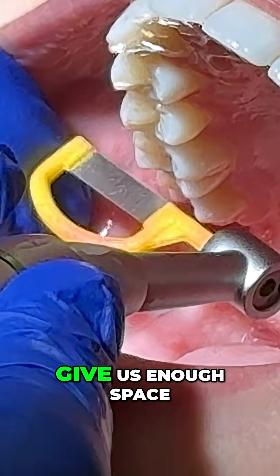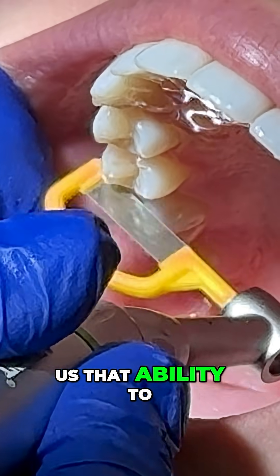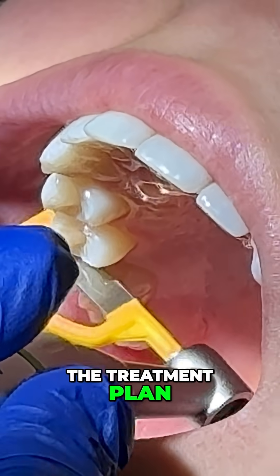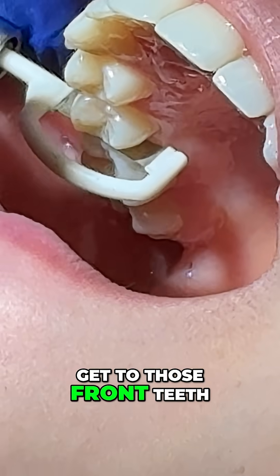And so that will give us enough space to move and shift the teeth and give us that ability to align those teeth. In this case, we're doing IPR at three different steps during the treatment plan. And as the teeth straighten up a bit, it'll be easier to get to those front teeth which are crowded.